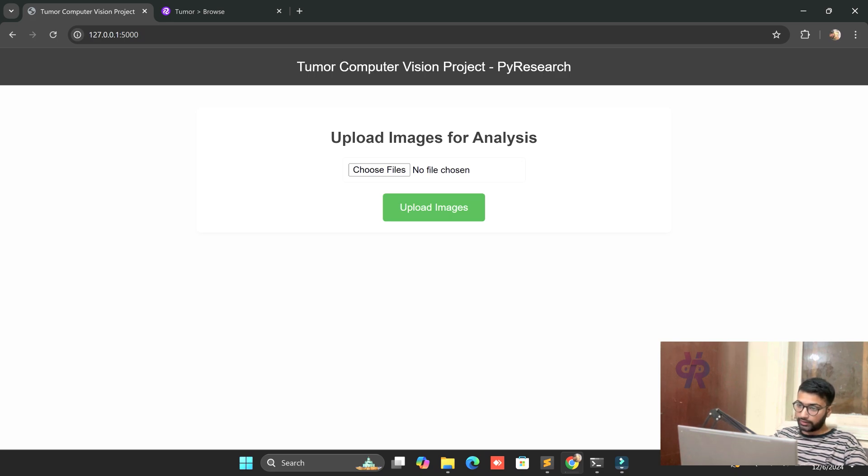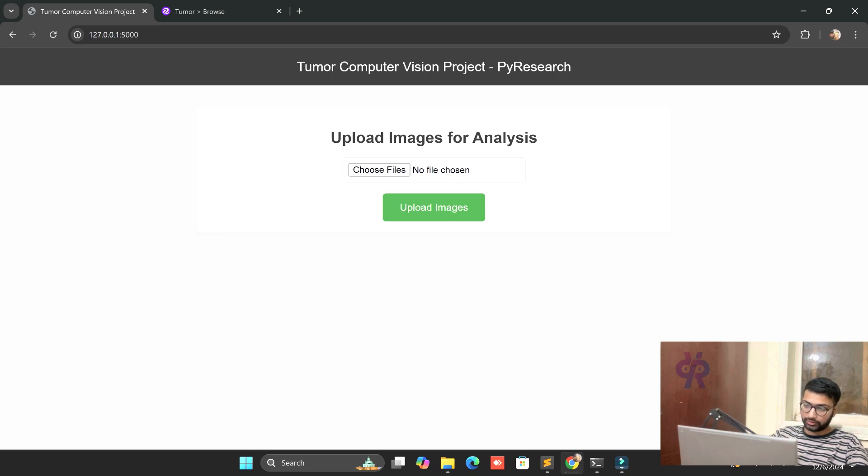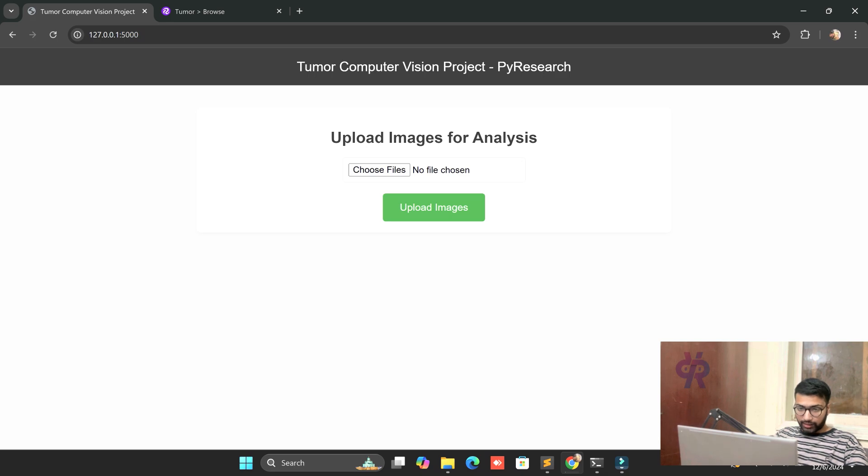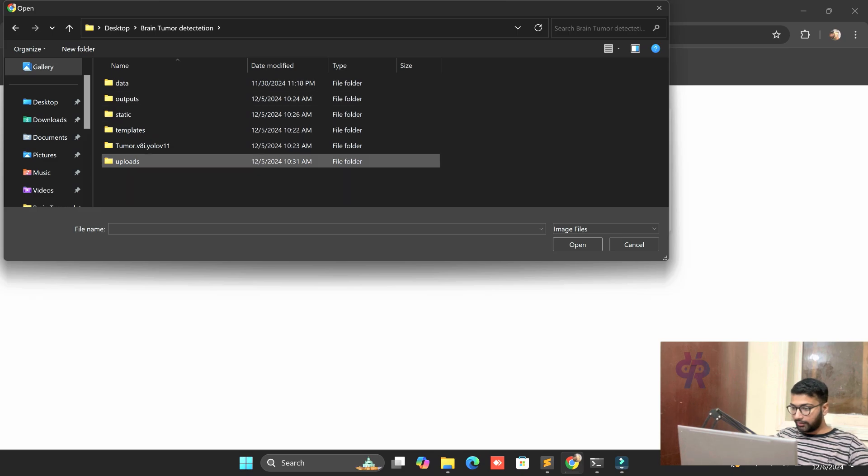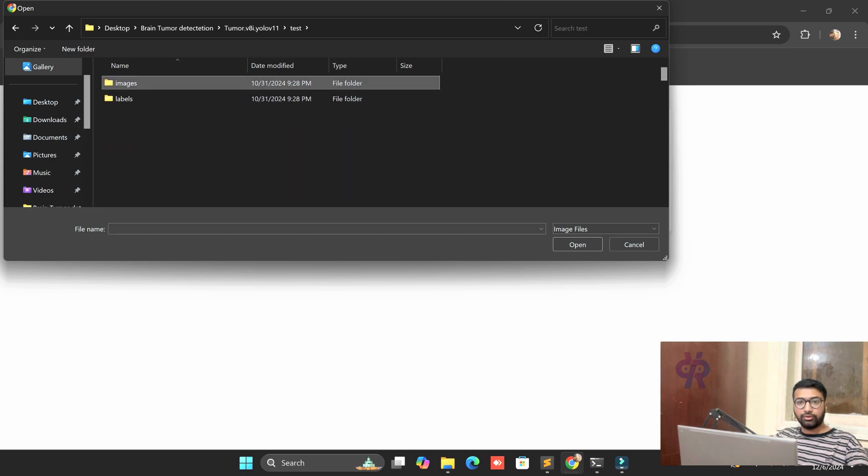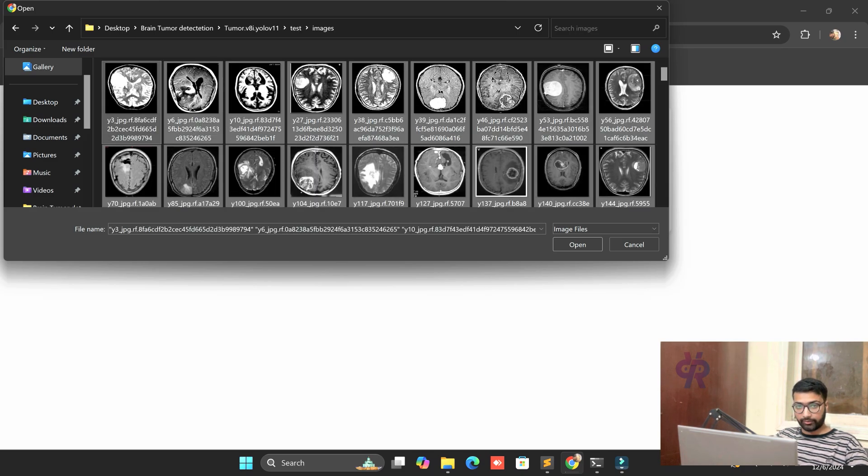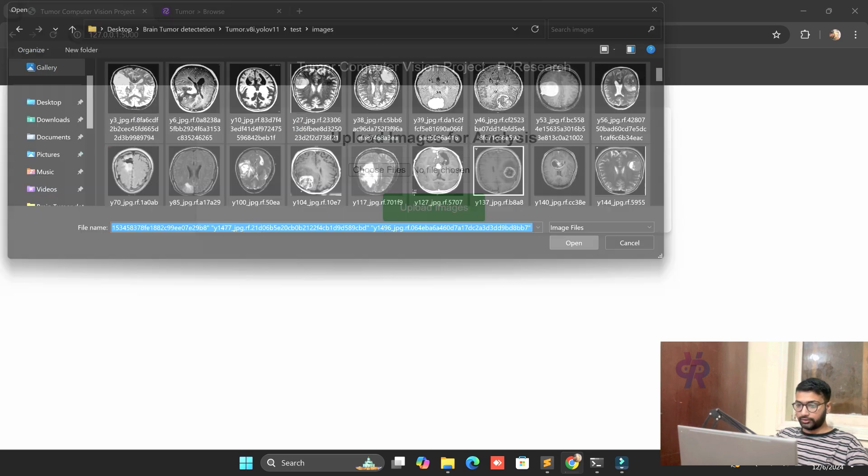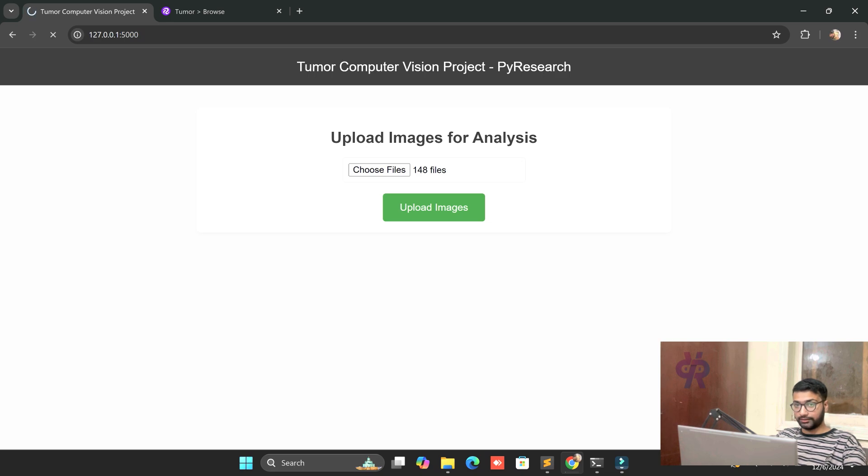PyResearch helps with new videos every week. Now we discuss the tumor computer vision project. Let's start from scratch. First of all, you can see the interface to choose files. I have test images here, and I am uploading all 148 images in front of you. We upload the images and see the results.